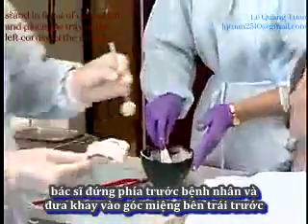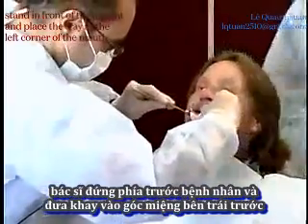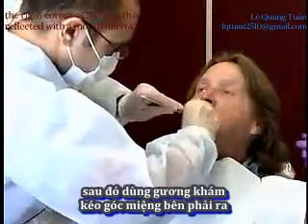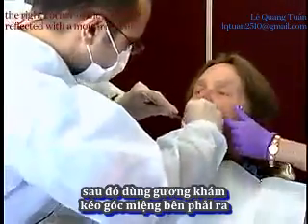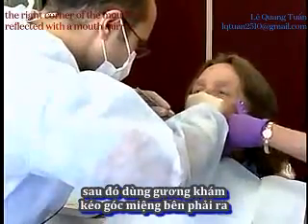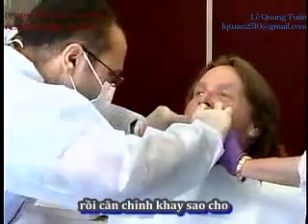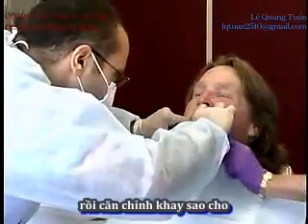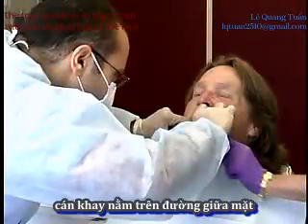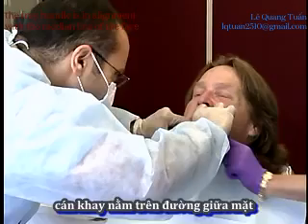Stand in front of the patient and place the tray at the left corner of the mouth. The right corner of the mouth is reflected with a mouth mirror. Center the tray over the residual ridge so that the tray handle is in alignment with the median line of the face.